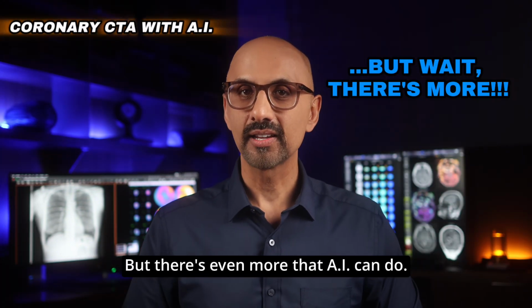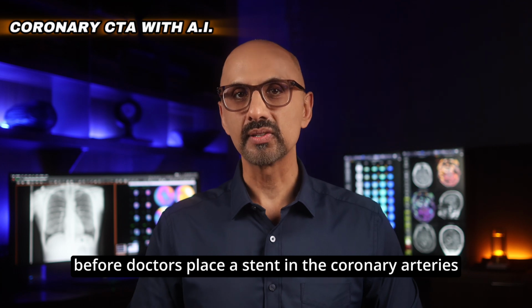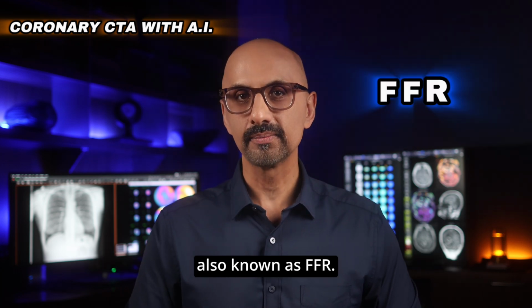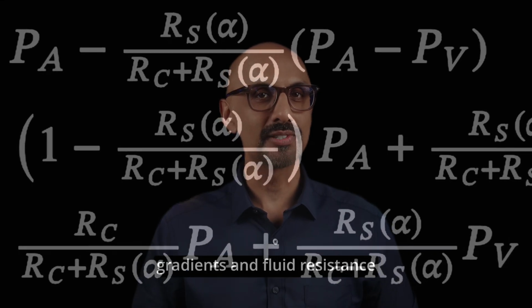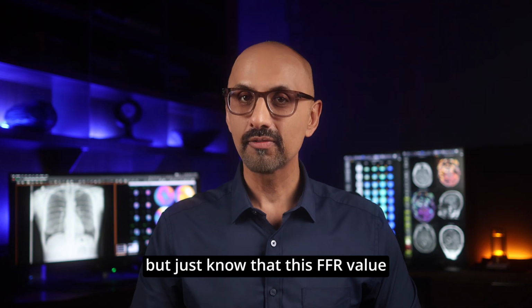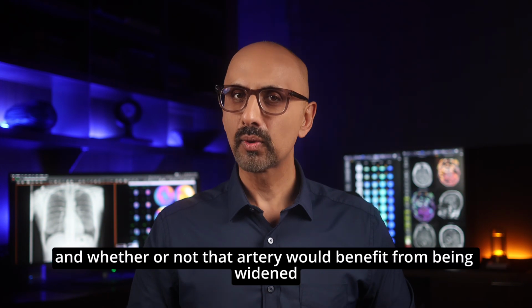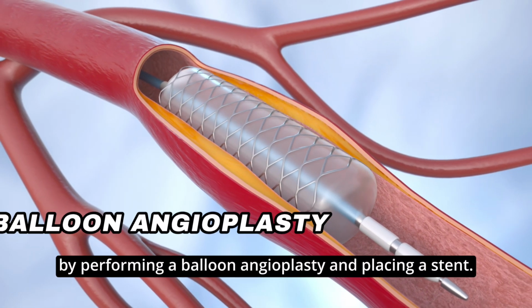But there's even more that AI can do. In our last video, I mentioned that before doctors place a stent in the coronary arteries, they often measure something called Fractional Flow Reserve, also known as FFR. Now, I'm not going to bore you with all the technical details about pressure gradients and fluid resistance, but just know that this FFR value basically tells doctors how well blood is flowing through a narrowed artery and whether or not that artery would benefit from being widened by performing a balloon angioplasty and placing a stent.